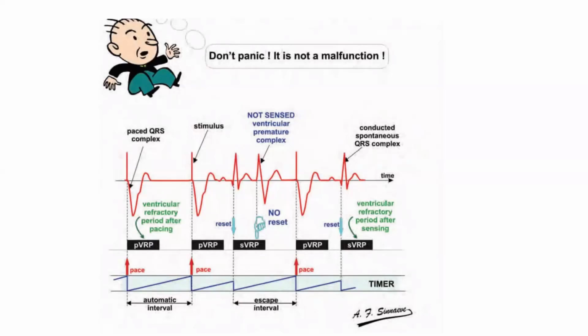It just happened inside the refractory period. So for the pacemaker, it's 1, 2, 3, 4 beats. The real fourth beat is not sensed because it came inside the refractory period. And this is very important, because as you advance in troubleshooting and reading pacemaker tracings and answering cases, you'll see that sometimes there is a problem in sensing, and you need to differentiate: is it a real problem, or the pacemaker was right and it was justified not to see this because it happened inside the refractory period.